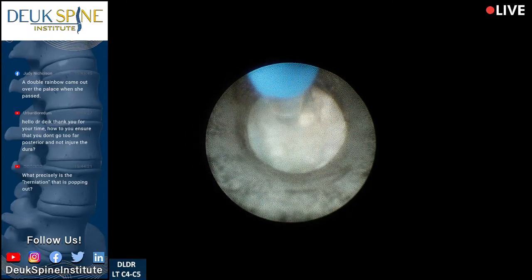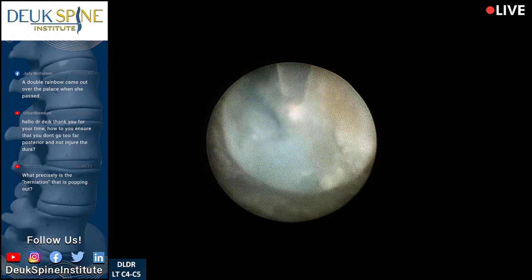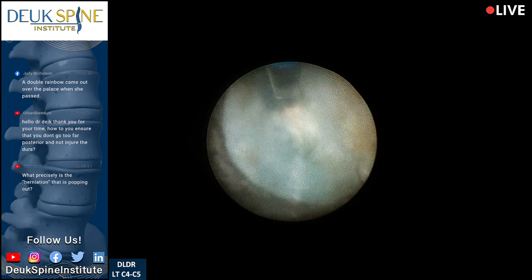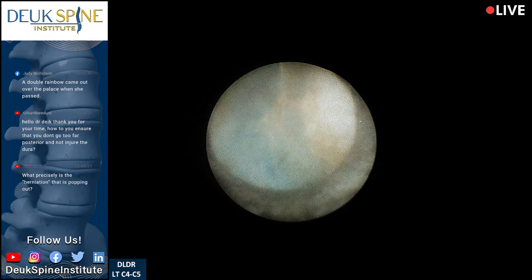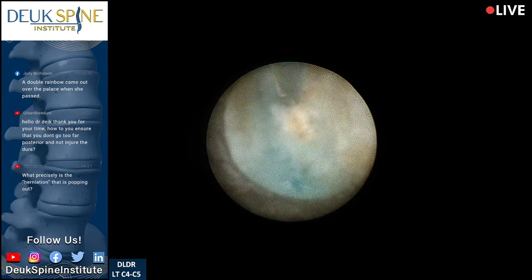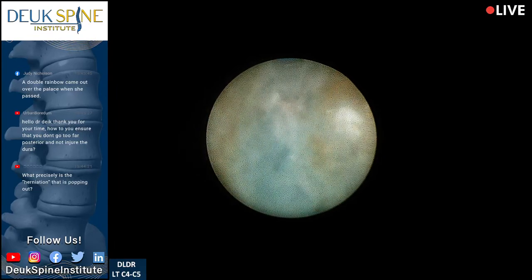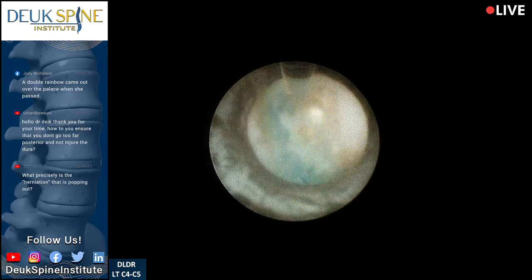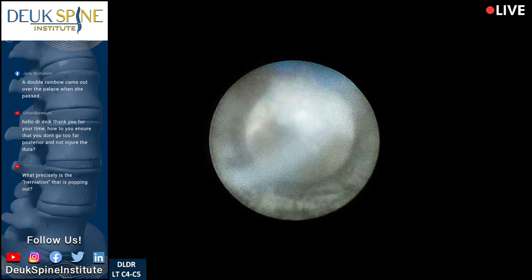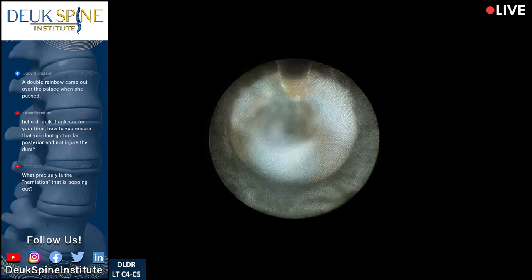This is all scar tissue in the right foramen at C4-5, and this is some herniation in here. I'm trying to see if there's any more herniation left — this is going out into the foramen where the nerve root is. I don't see any more herniation; we've gotten rid of it all. This area is the foramen, and this is where the herniation was sitting — the two big pieces were paracentral, next to the center, and this is all scar tissue from inflammation. This poor woman has suffered for years.